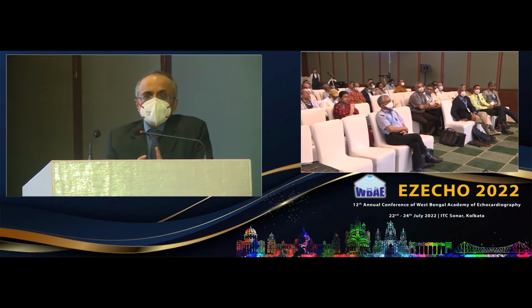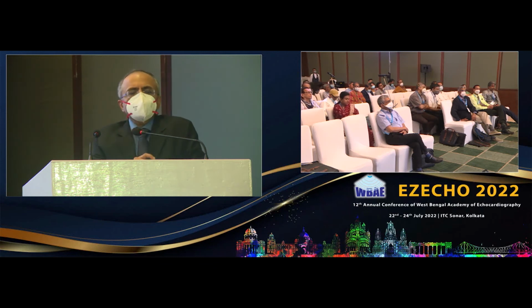GLS. The interesting thing is that the GLS at rest of these patients can be still low, even if they have an athletic heart. So GLS, I won't ask you to do it, because it can fall in the athletes at rest. But the moment you exercise them, their EF increases and GLS increases. HCM, it will never increase.